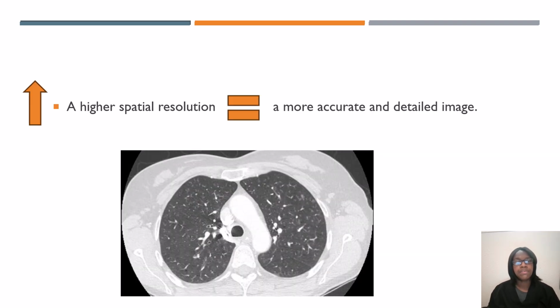Just remember, whenever you increase or have a higher spatial resolution, this equals a more accurate and detailed image. So that's what we want. We want something with a higher spatial resolution if you're looking for more detail.